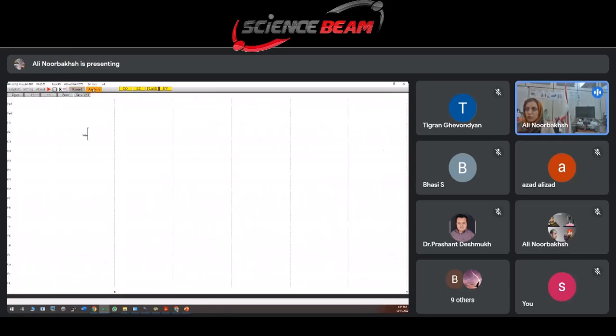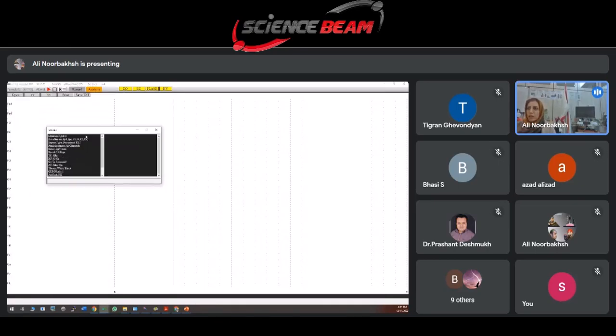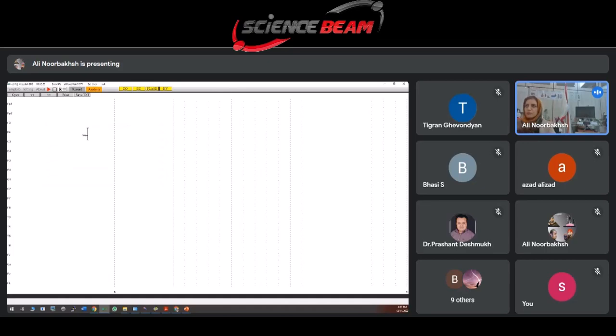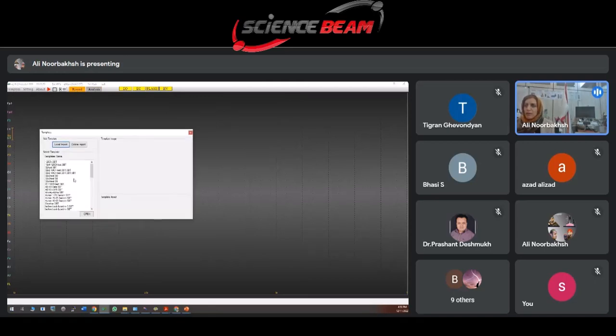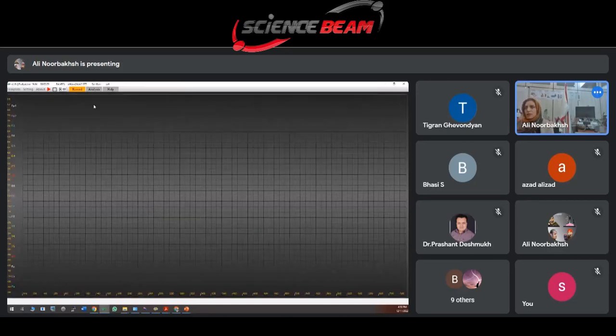And there are a lot of montages in this page. You can see a lot of montages. You can make a montage if you want. You can write it in this page. You can use it just for EEG recording. But for QEEG, we should go to evaluation 19 channel. Now it's converted.